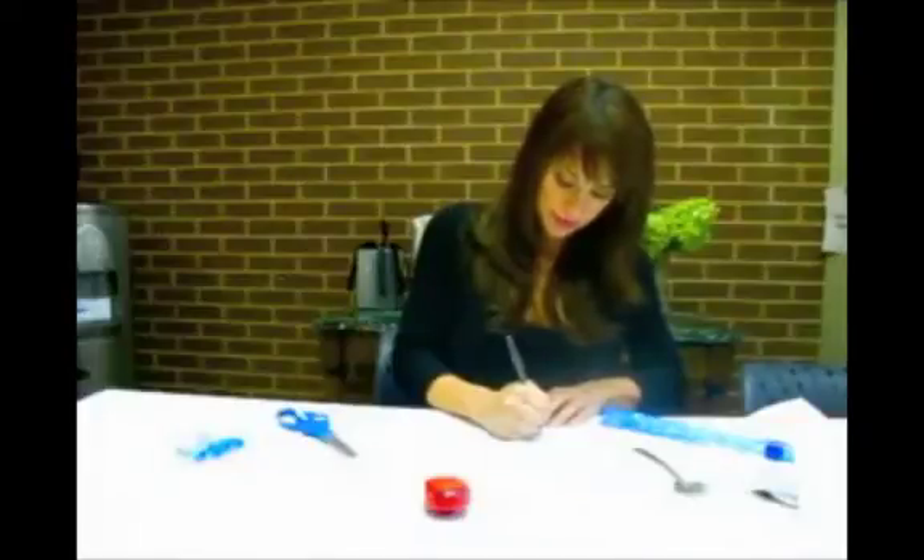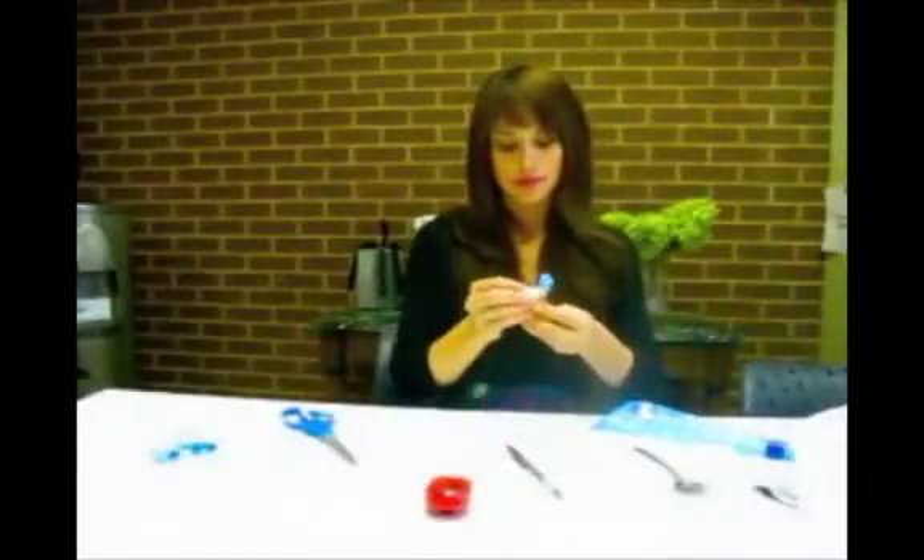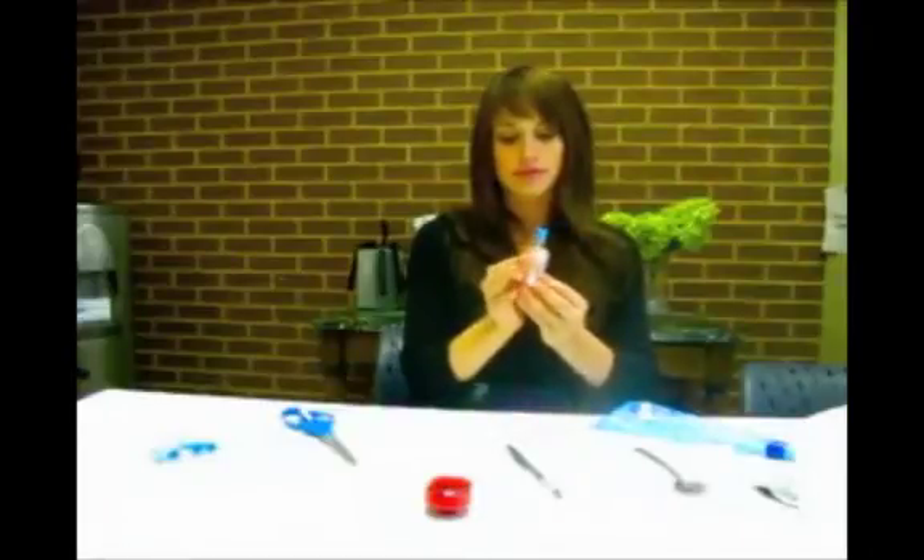Take a moment to write down the requested information on the 6 labels. Then place one of the labels on the first tube.